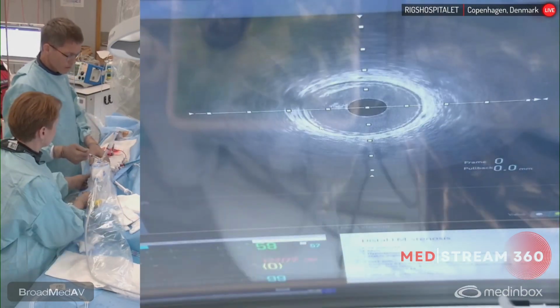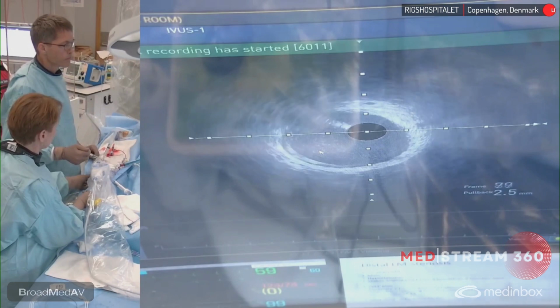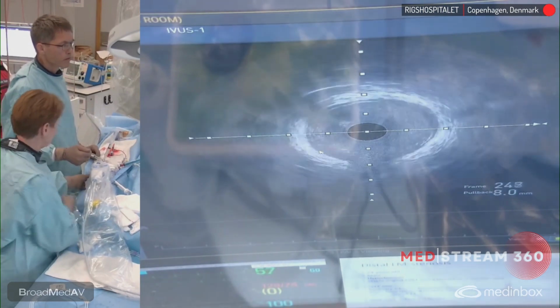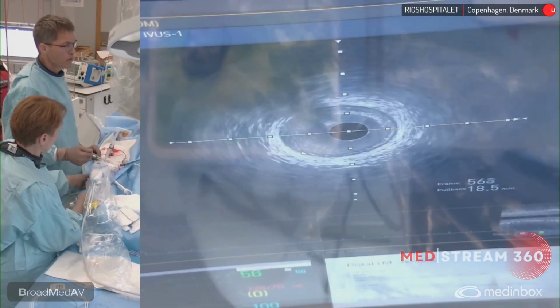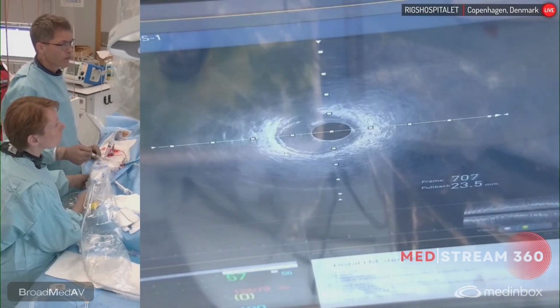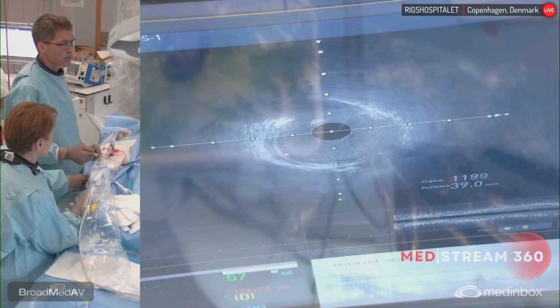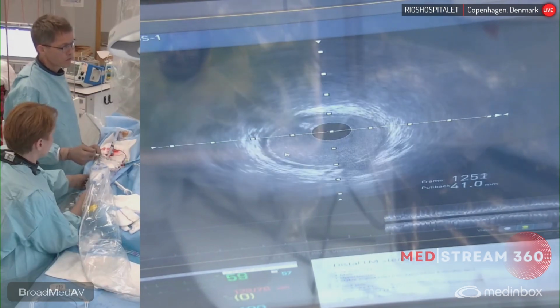And here we start out in the distal part of the LAD, where we have a very nice vessel here, 2.5, 3 millimeter, side branch coming in there at 6 o'clock. Now we see some plaque here. That's a mid LAD. We're entering the plaque and some narrowing. Here we see there's definitely some plaque. Now approximately, it might be some bridging. We'll have to look into that.